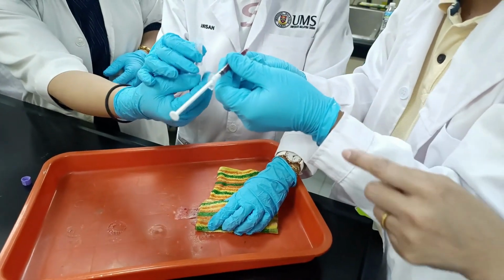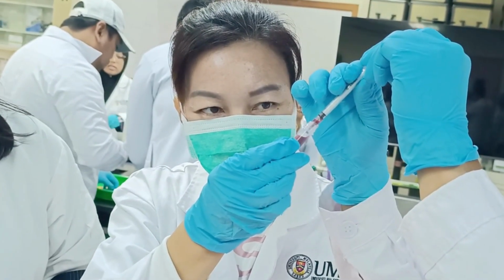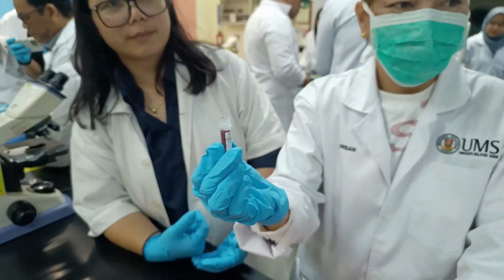After the blood has been collected, carefully remove the needle and immediately transfer the sample into a clean, properly labeled microcentrifuge or Eppendorf tube for further laboratory procedures.